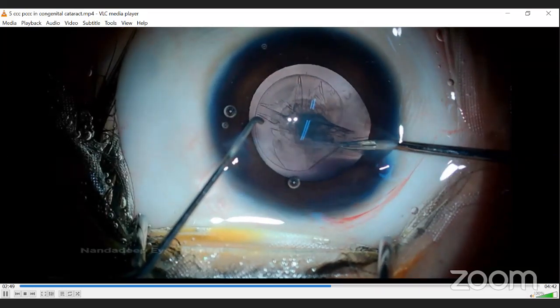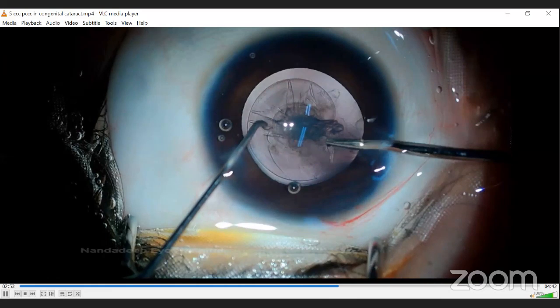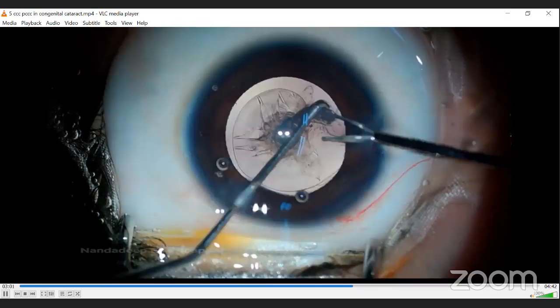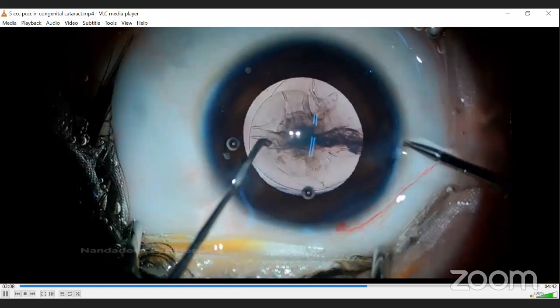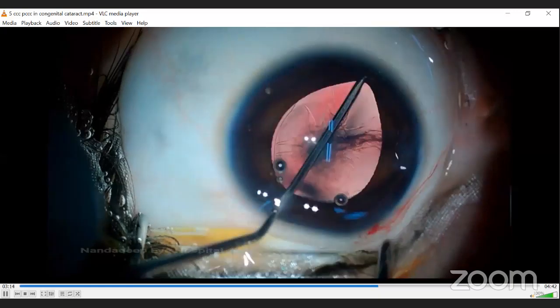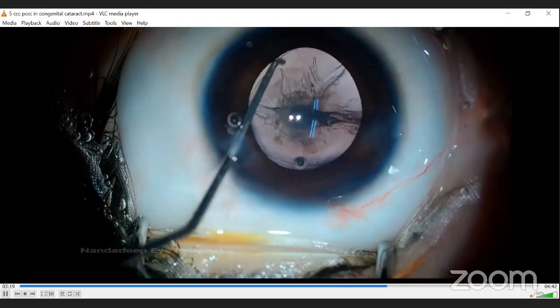So watch here now, I'm using shearing force in between and it started going out. So I have to use strong tearing force here and pull it back. But the moment it starts going out, it will become bigger no matter what you do. So the CCC has become bigger here, but luckily it's not torn, it's complete. So we can proceed with safe surgery.